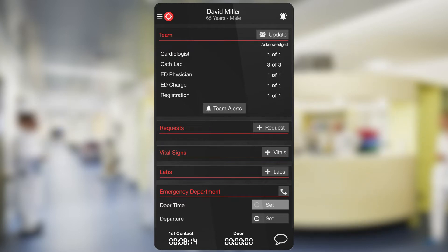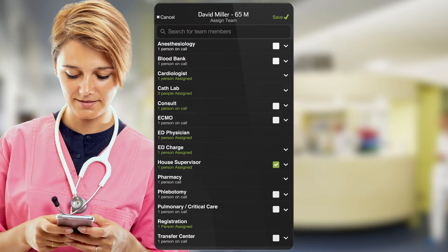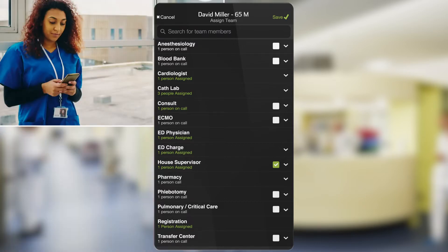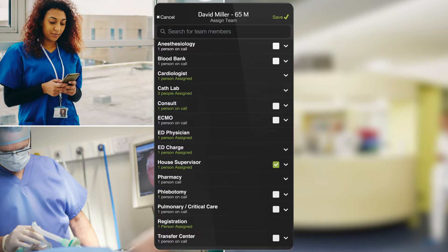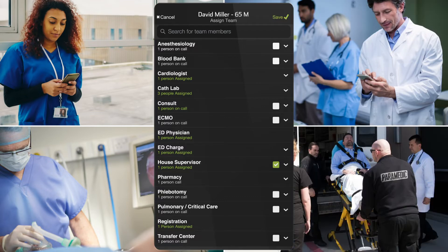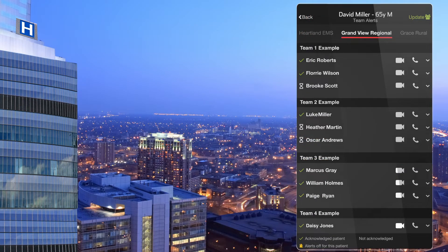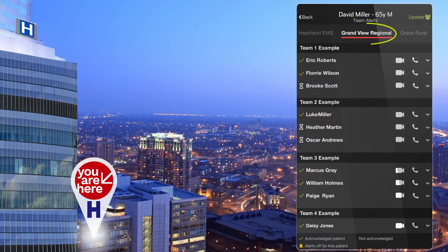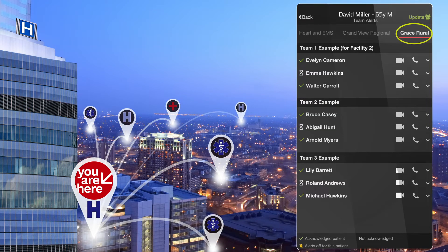Finally, if at any point during the patient's care a clinician needs to add additional team members, they can do so with a tap. An example might be adding a house supervisor as demonstrated here, or in the rare case you need anesthesia for assistance in intubating a deteriorating patient, or even adding a new inter-facility consult or transfer request. One of the things that makes Pulsara so unique is that the entire care team is visible — this includes individuals at your organization as well as EMS providers and individuals located at other organizations using Pulsara for transfer or consult purposes.